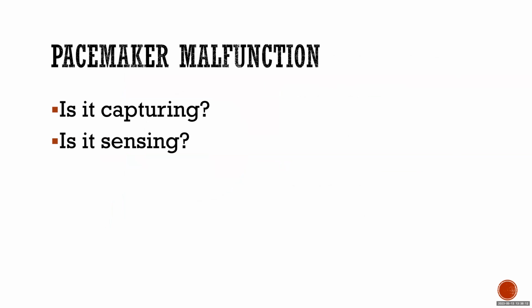This can be really complicated, even for senior consultants, because every company has different programming and so on, but the basics are not that different. So when you think that there is pacemaker malfunction, you ask yourself 2 questions. Is it capturing? And is it sensing? And you should cover most of pacemaker malfunction that way.